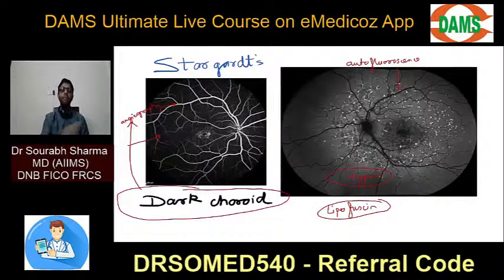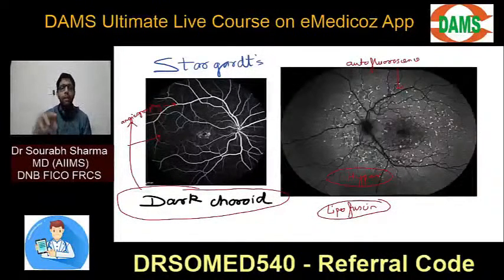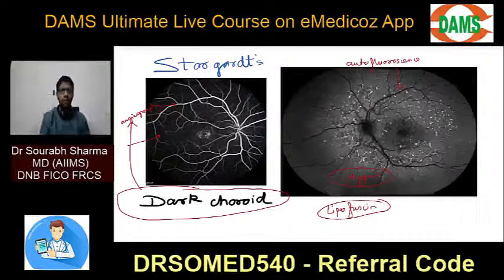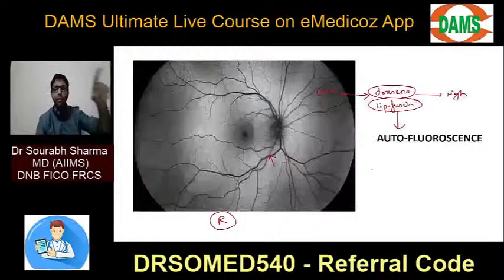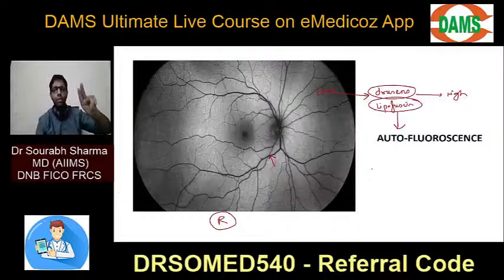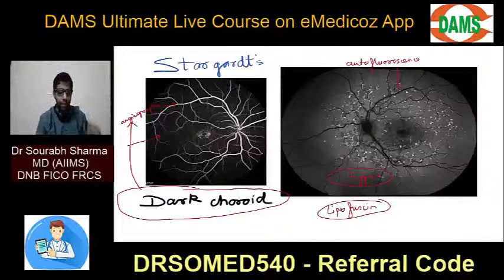Okay, so these are some points which you want to know for autofluorescence also. I've just told you one extra. From angiography, I've taken you to autofluorescence. And how to differentiate? Vessels have dye, angiography. Vessels don't have dye, autofluorescence. Just remember 2 points for autofluorescence. Drusen, lipofuscin, 2 depositions which have the property of autofluorescence. Okay? Alright.